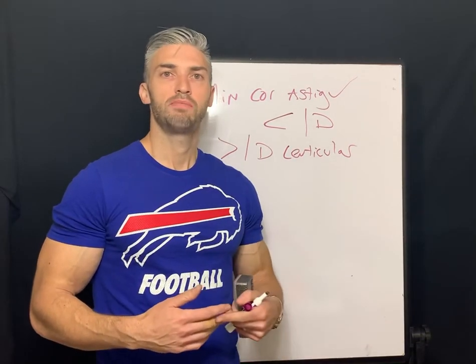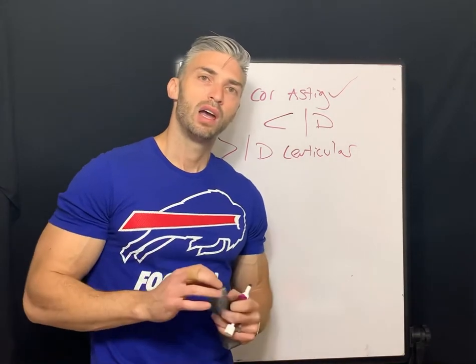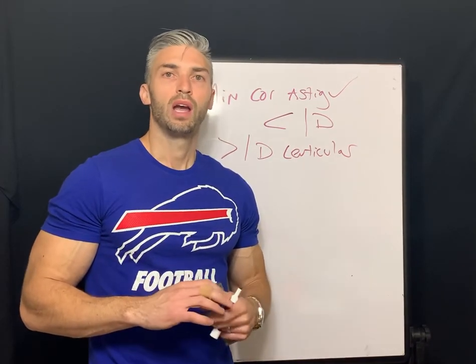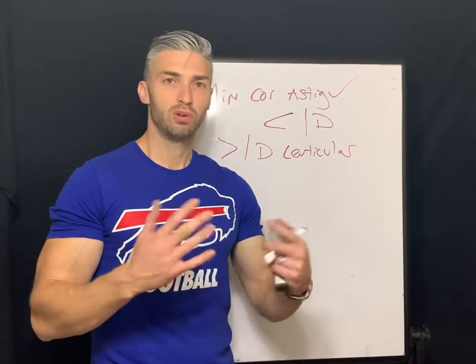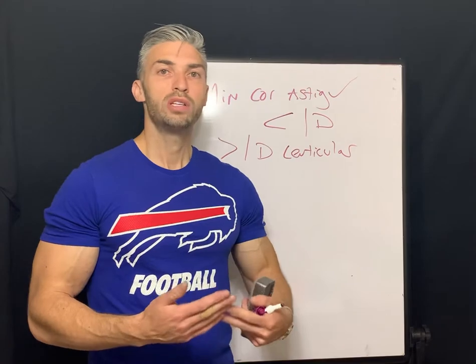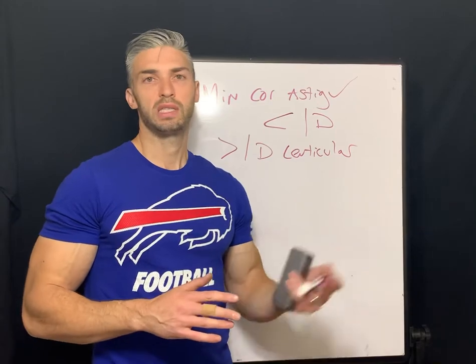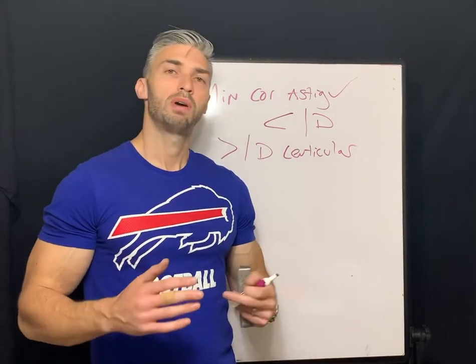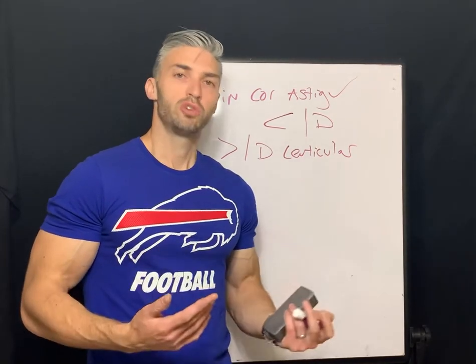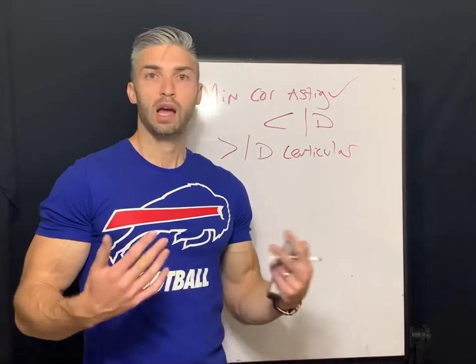Because a keratometer is just measuring the corneal steepness. And just remember this, the keratometer measures just a 3 millimeter zone on the cornea, the corneal cap. So it's not measuring the full cornea, but just that small area, which is enough for contact lens fitting in general. But your cornea is going to flatten towards the periphery. There's all sorts of astigmatism. There's even scleral astigmatism that could be present. But just remember that with front surface toric, you're dealing more so with the residual astigmatism. It could be after you fit a lens and there's an over refraction and it's not coming from the cornea.